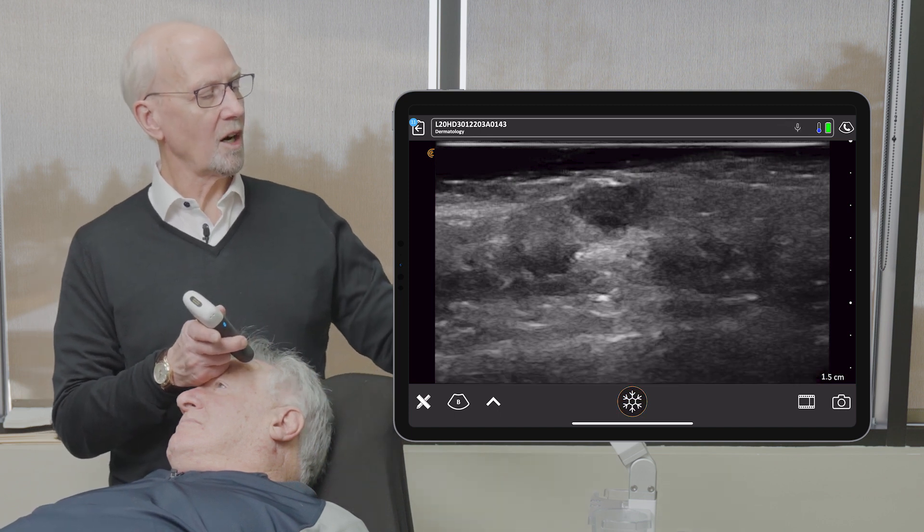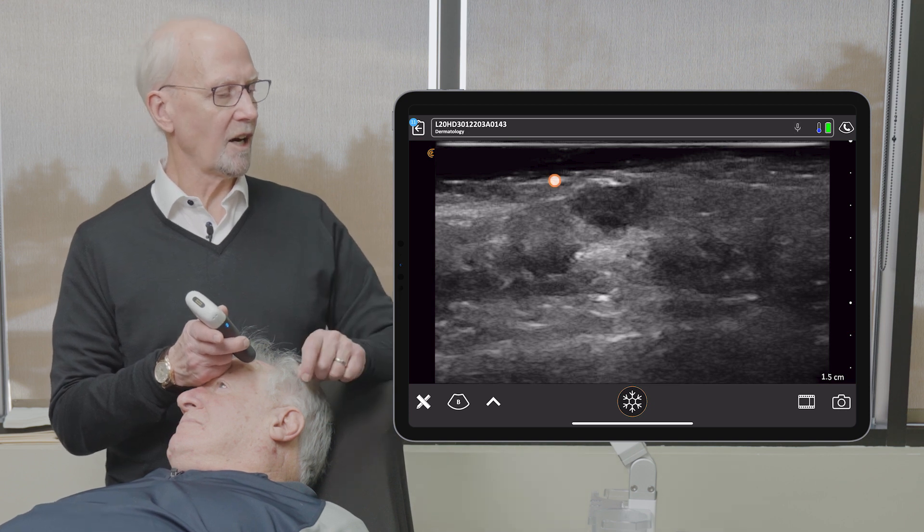In looking at our lesion, we can see the surface skin is contiguous. There's some keratinization.